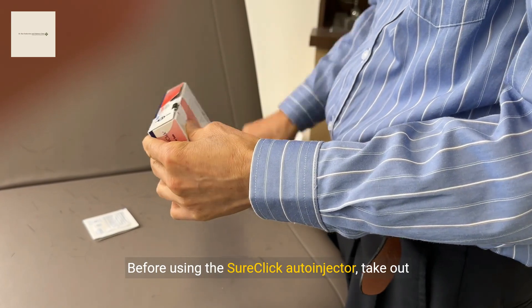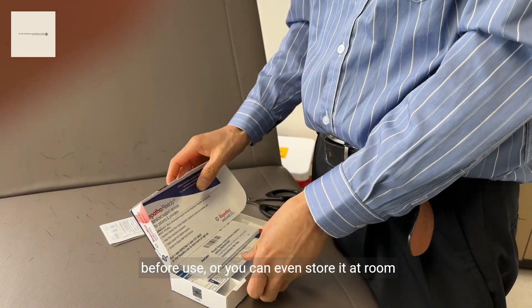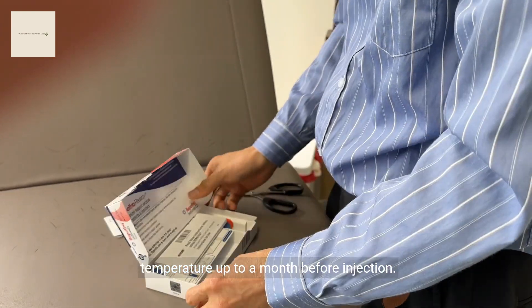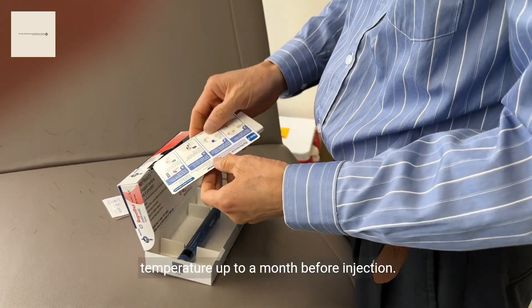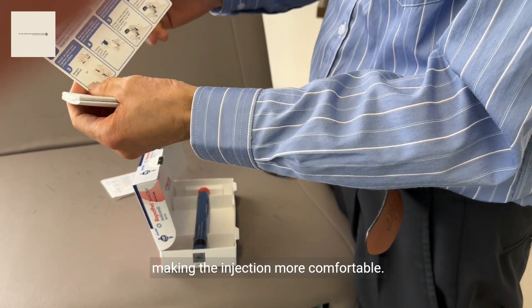Before using the SureClick auto-injector, take out your Repatha from the refrigerator 30 minutes before use, or you can store it at room temperature for up to a month before injection. This helps bring the medication to room temperature, making the injection more comfortable.